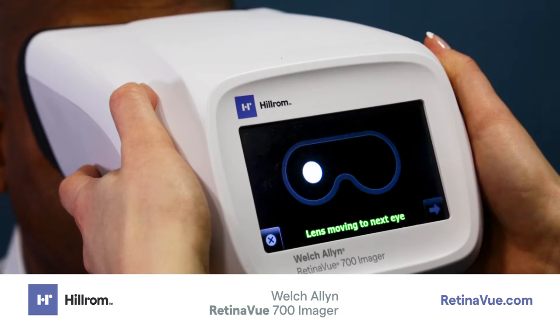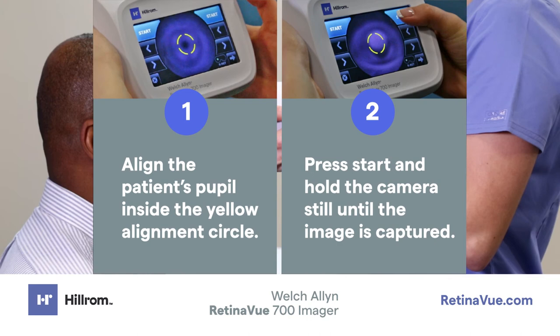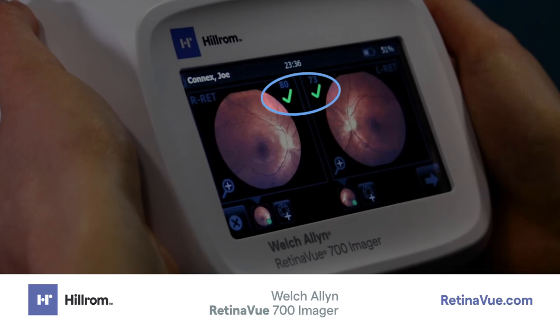During transition, you can either leave the imager on the patient's face or remove it from their face while the imager transitions to the left eye. Repeat the steps to align the pupil to the yellow circle and capture an image of the left retina. Once both images have been captured, the acquired images will be displayed on the post-acquisition screen. For each image, there is a quality assessment. The quality assessment indicates the likelihood that the image is interpretable by an eye care professional.